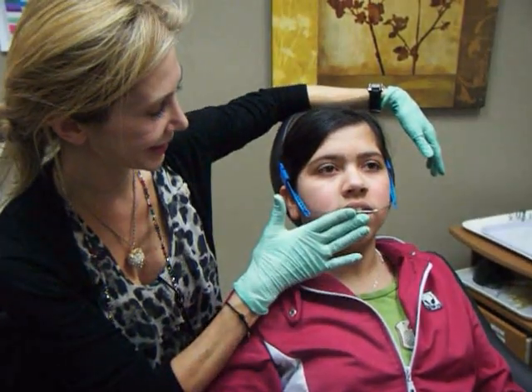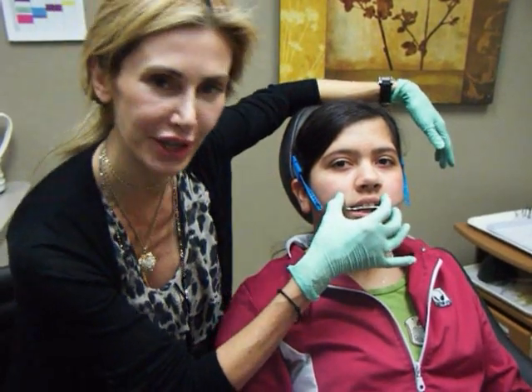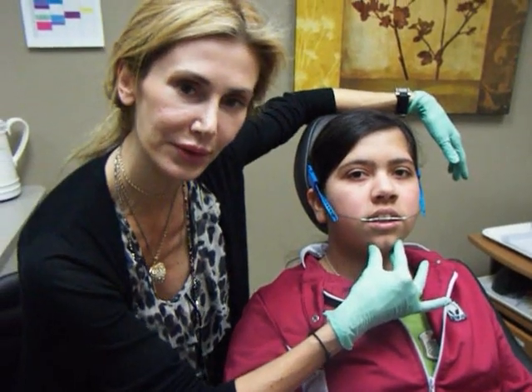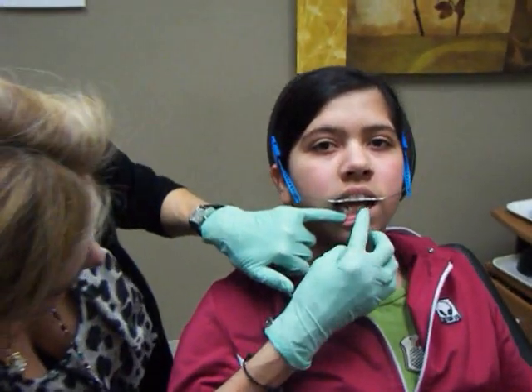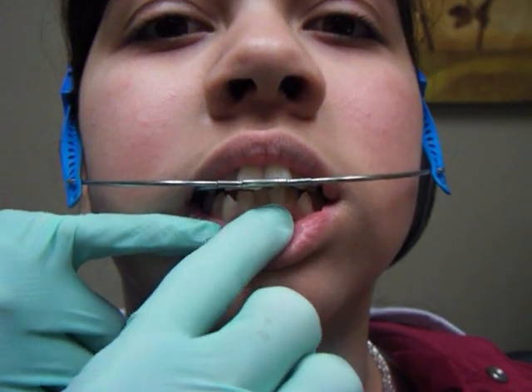The idea behind this is to slow down the forward growth of her upper jaw, allowing her lower jaw to continue to grow forward and thereby balance her facial profile and correct her bite position. So we have a protrusion of her upper teeth over her lower teeth, and that will be partially corrected by the wearing of the headgear.